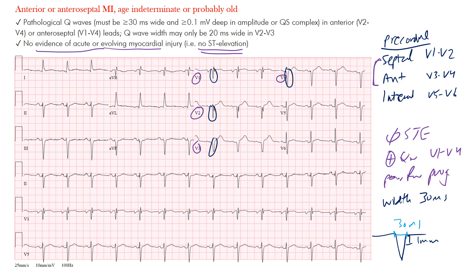No evidence of the ST segment elevation injury pattern, localizing to V1 through V4. We also mentioned poor R wave progression — normally from V1 to V4 or V5 there should be an increase in R wave amplitude and an increase in the R-to-S ratio. In this example there is pretty much absence of R waves, with R waves only starting to appear around V4 to V5, which is quite late.